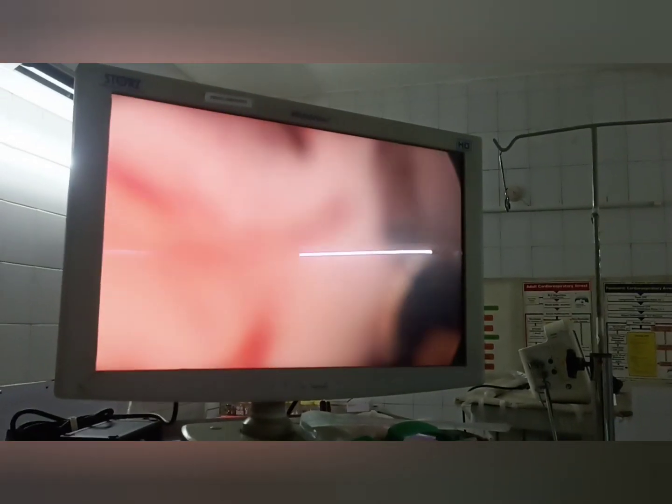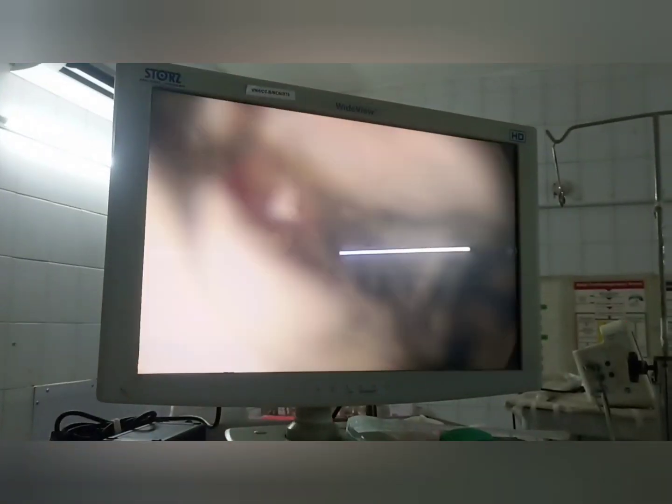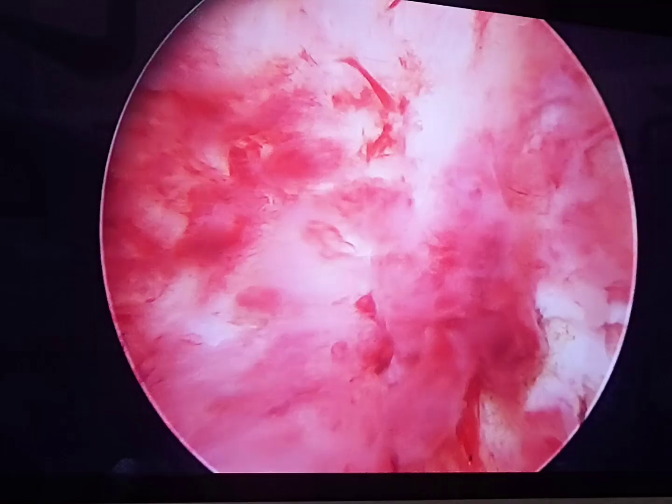The grasper pushes it towards the fundus, detaching it, and then gradually brings it out. Like this, the whole polyp can be removed. This is a post-polypectomy image. Thank you.